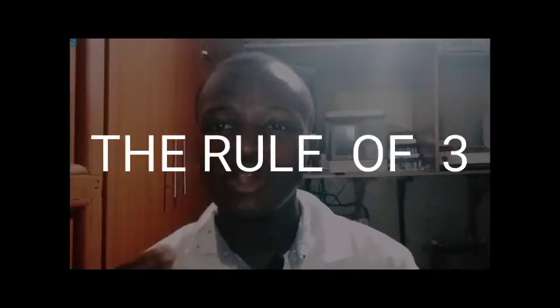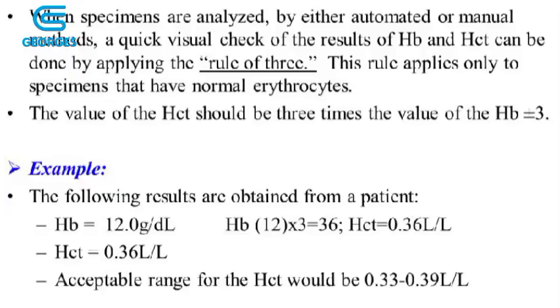There is a rule called the rule of 3, whereby when you take the hemoglobin times 3, you will get the hematocrit. And of course this is subject to plus or minus 3. And also when you take the red blood cells and you multiply by 3, you will get the hemoglobin, and this is also subject to plus or minus 3. The reference range of hematocrit in male is 38 to 54, and in female it is 34 to 46.5.